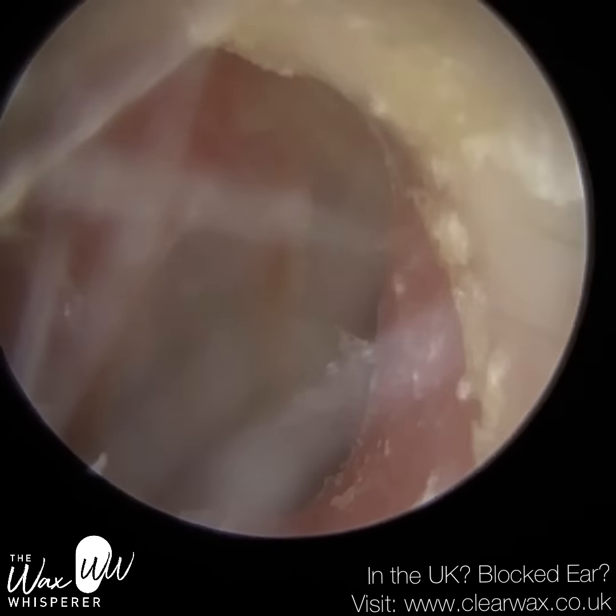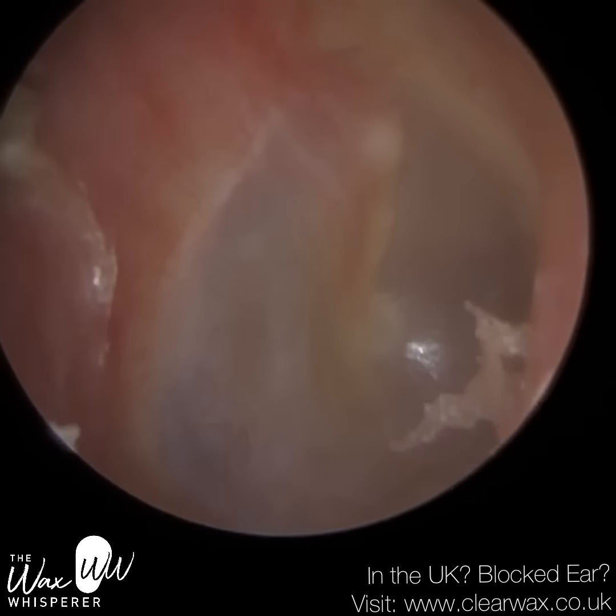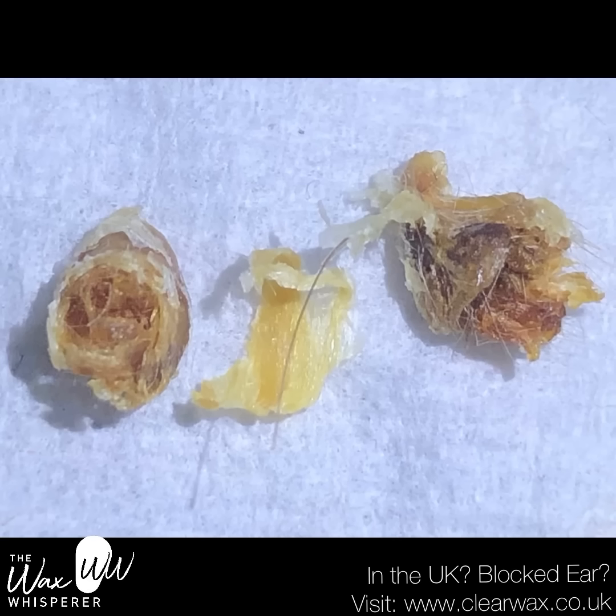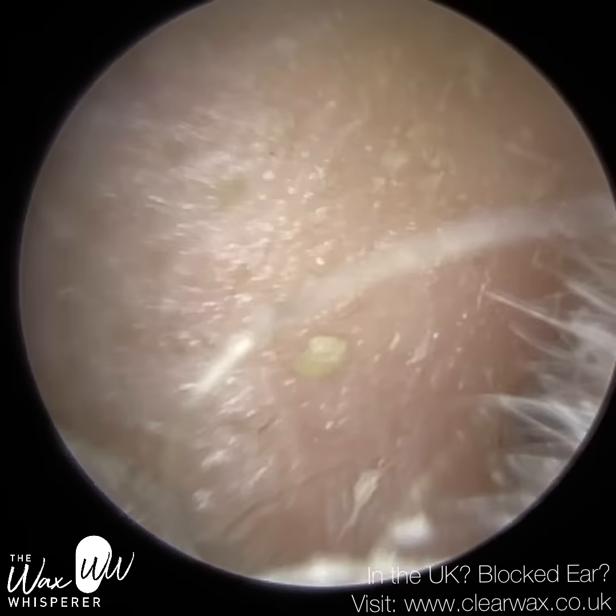I didn't want to use any suction because we haven't so far, and that would have just clogged, I suspect. Nice healthy eardrum. There's a bit near the entrance that I just used the elbow of the St. Bart's hook to maneuver out. So that's a still image of the balls of keratin and dead skin that I peeled away.